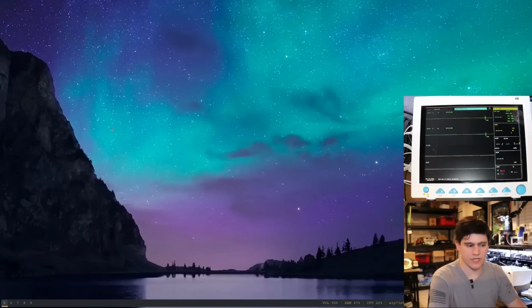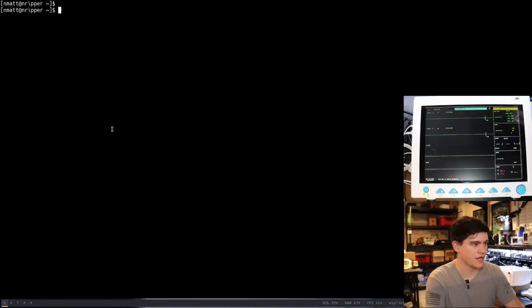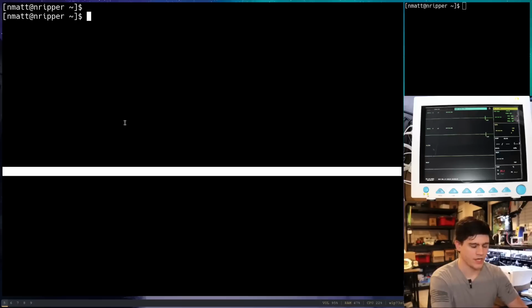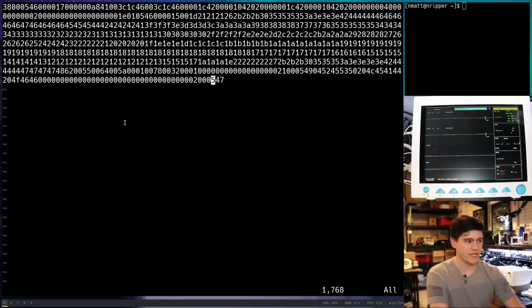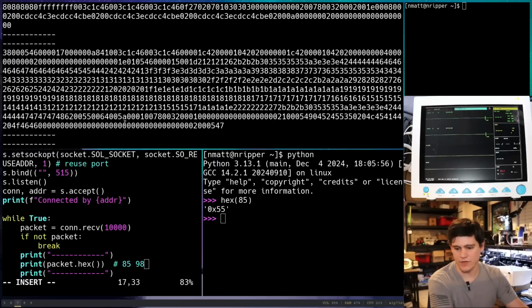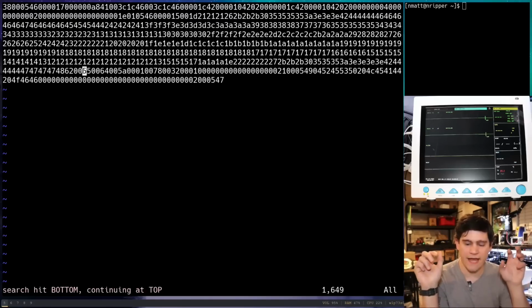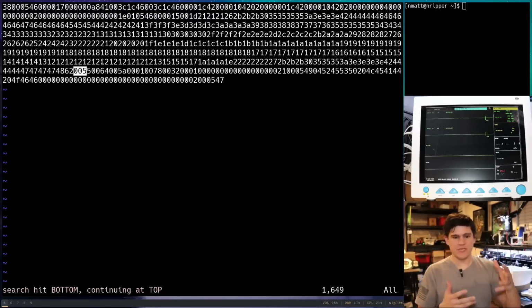So we're gonna show, for reals, how I do some of this reversing. Some of this is really funny and sketchy, but I will open Vim and copy all this binary data here in this packet. So what do we need to look for? We need to look for a 55 byte. Well, there we go. We see a 55, and after it there's a 00. Now, there's also a 00 before it. I know that this is sometimes not a 0, so I'm just gonna speed us ahead and give us that hint.